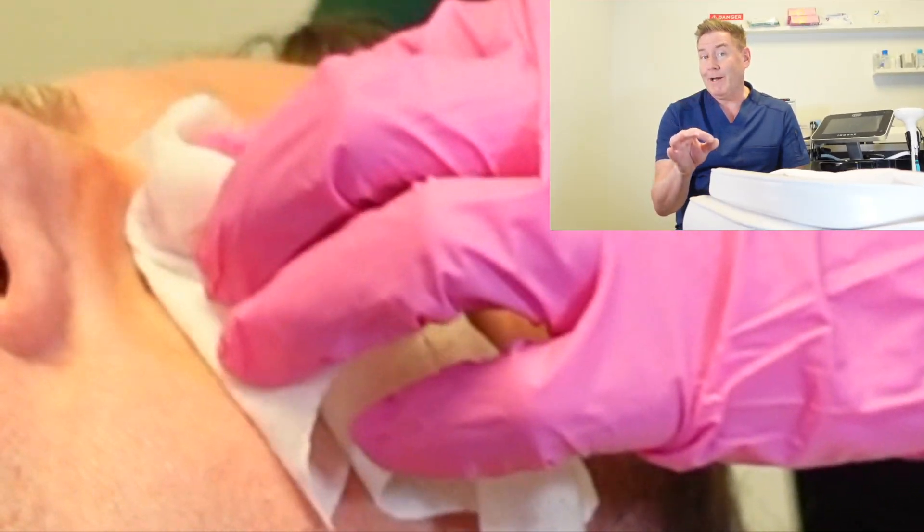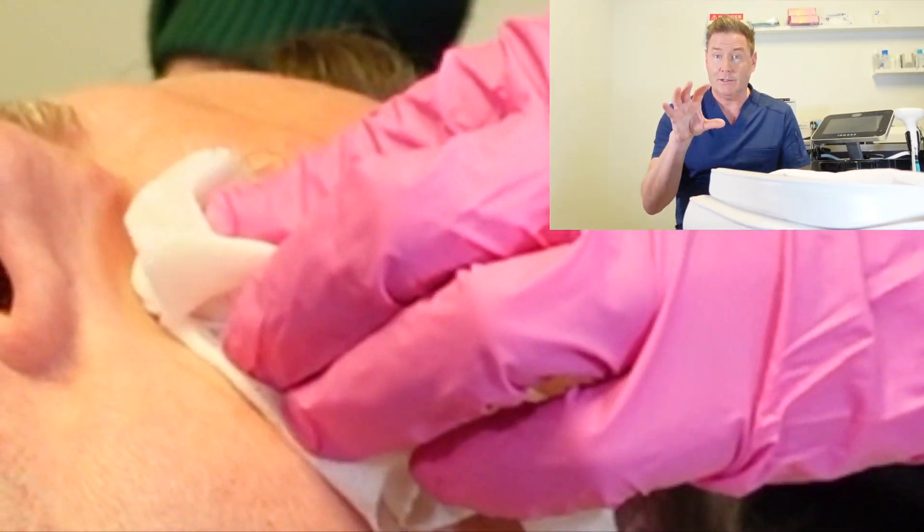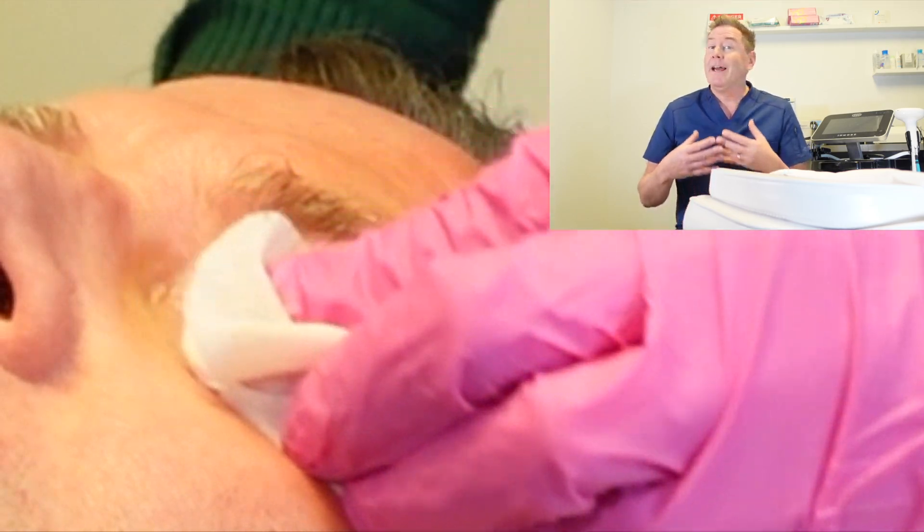First let's talk about how this feels when it's done and does it hurt. Think of radio frequency as a hot stone massage for your eyes. When you arrive for your appointment the ocular hygienist is going to first clean your eyelids and around your eyes.